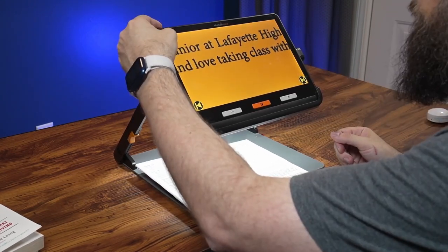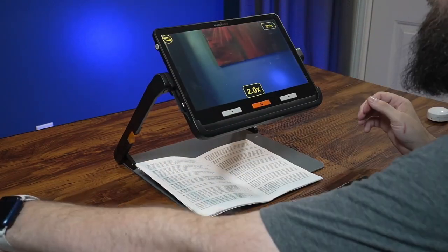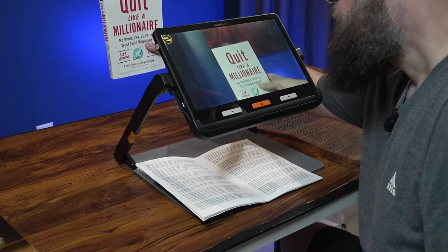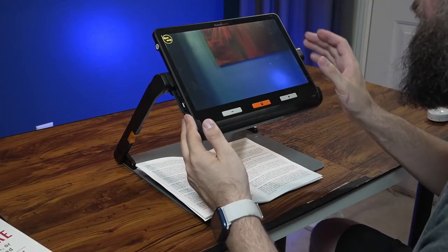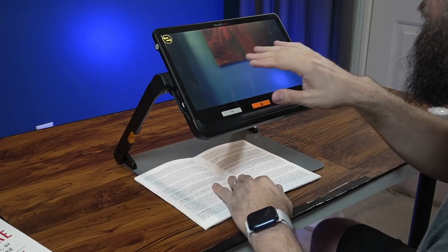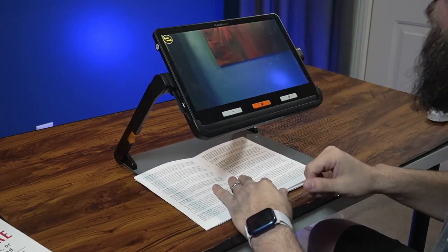Also in live view while docked, you can tap the icon to switch to distance viewing. This would definitely be nice for a student in a classroom — they can quickly jump into distance viewing to see the front of the classroom, see the board, and see what the teacher's doing up there.